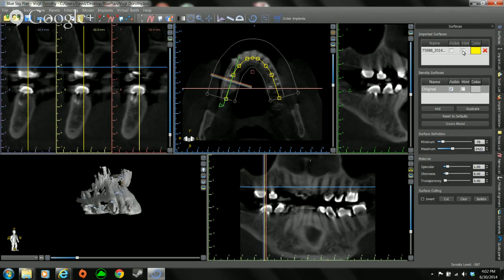A low per-case fee, starting at $11 per case, allows a lab to control 100% of the process and to offer computer-guided products and services to their dentists. Surgical guides can be prepared for all guided surgical kits and all dental implant systems.